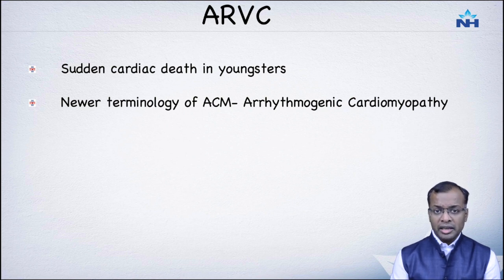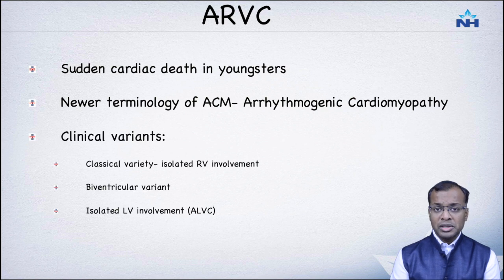The variance of presentation in this entity since its description, and with more and more use of imaging, we are finding that there are a lot of variations from the classical pattern that has been described. That has led to the formation of a newer terminology called ACM, or simply arrhythmogenic cardiomyopathy, rather than ARVC. Now let's look at the different forms of ARVC that one may come across.